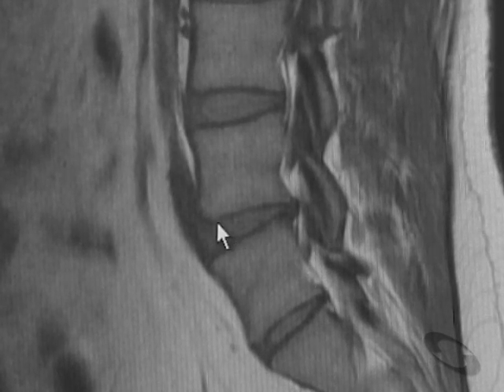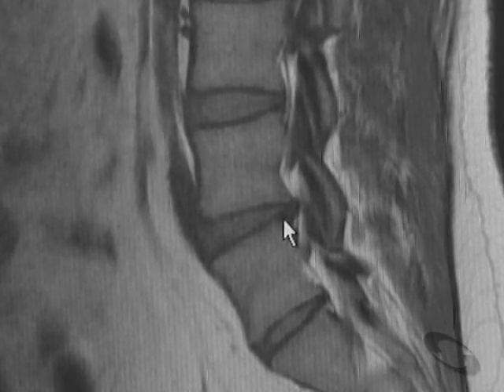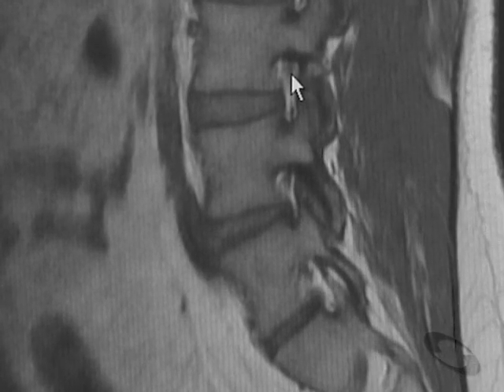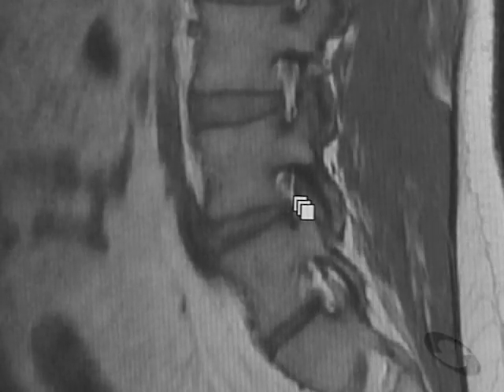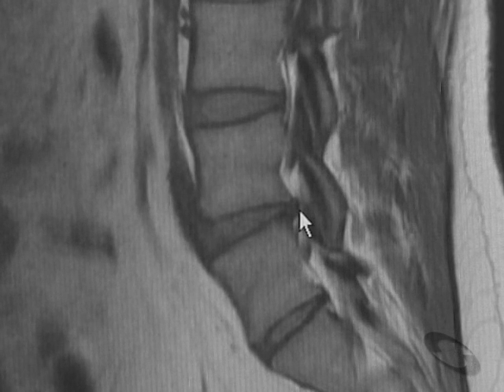What it shows is that the patient's disc space is collapsed posteriorly. There's a little bit of retrolisthesis where the L5 vertebral body is behind or posterior to the sacrum. As we scroll through here, you can see that the opening above for the nerve root is larger than this one, and there is some element of foraminal stenosis, mild, and the posterior annulus is bulging back posteriorly.